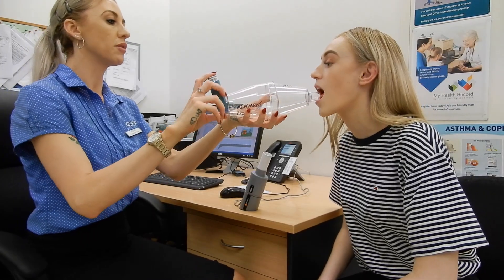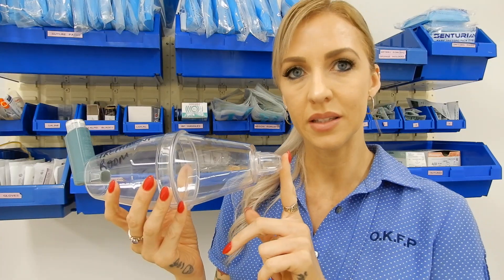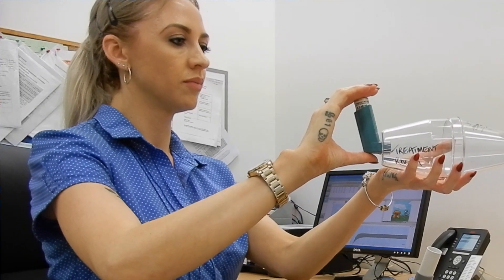Once you have completed the first three blows satisfactorily, the nurse will administer salbutamol via a spacer — many people also call this ventolin. This part of the spacer goes into your mouth. Again, form a tight seal around the mouthpiece with your lips so that no air or medication escapes. The nurse will administer the ventolin into the space chamber.